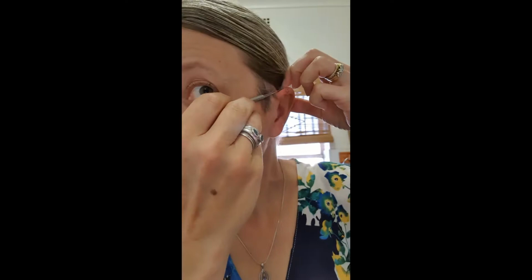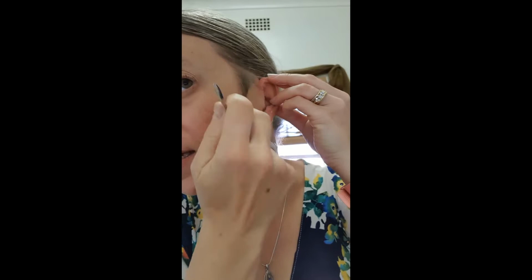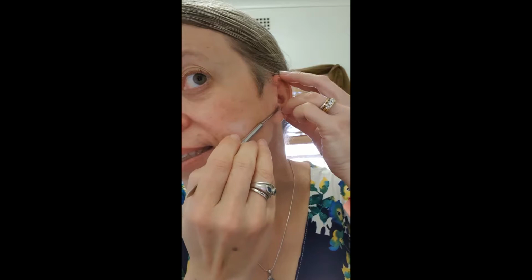So typically try and look from the back. And then I must try and not let it touch on the inside. I'm not that good yet because I've not done it this long. And you can see that little top of that ear, that is always my problem to get it physically in. And then there's hair in the way. There we go. It's nice and in. Get the hair out the way. Make sure it's properly in. Make sure it sits nice and snug here.